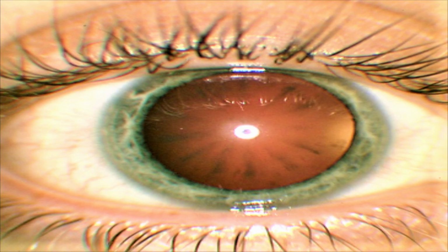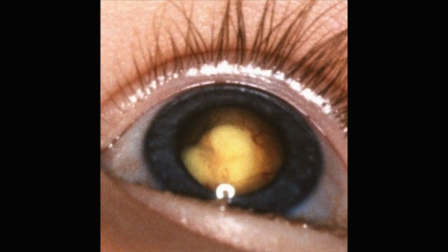The ophthalmoscope light is directed towards the pupil. This will show up as a red reflex, better if the pupil is dilated. This is helpful to detect any opacities in the media, such as a cataract, its spokes, particularly in an adult patient, or the absence of a reflex in a child with retinoblastoma.